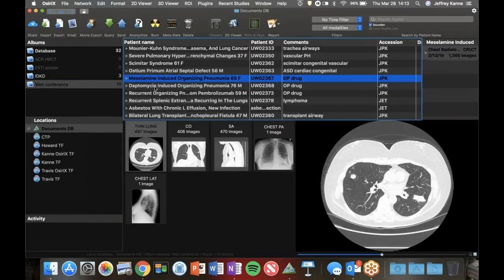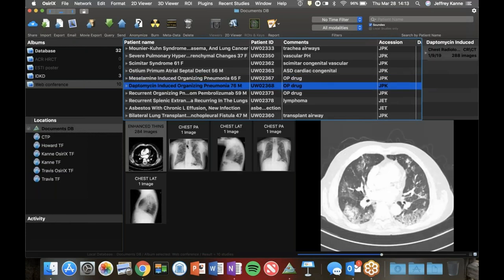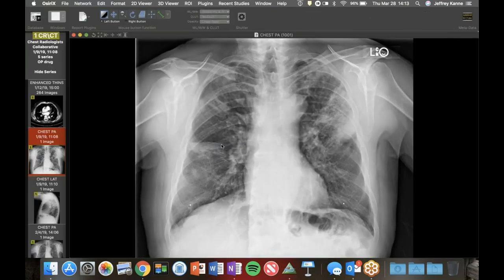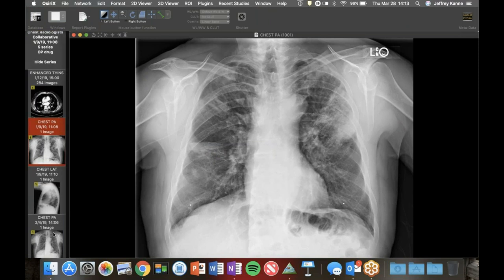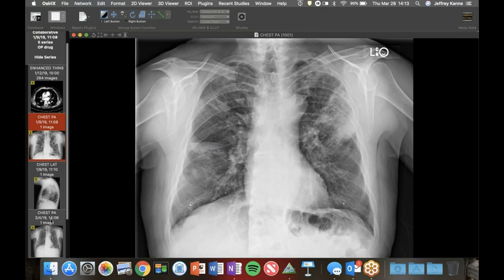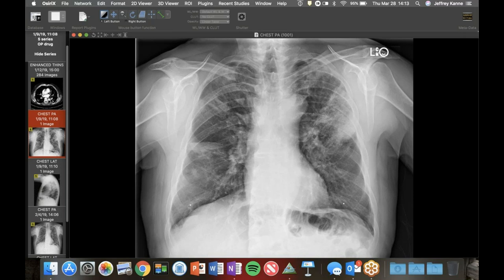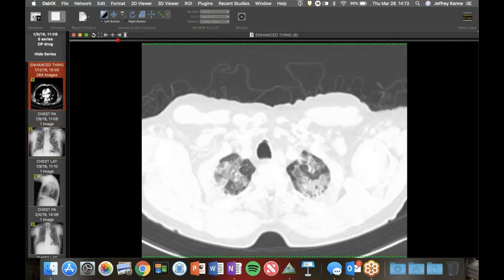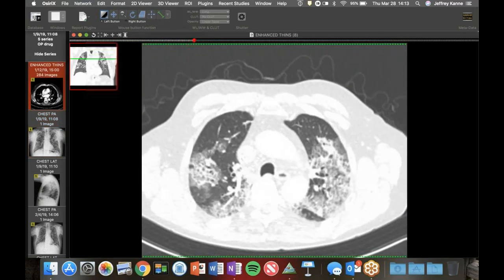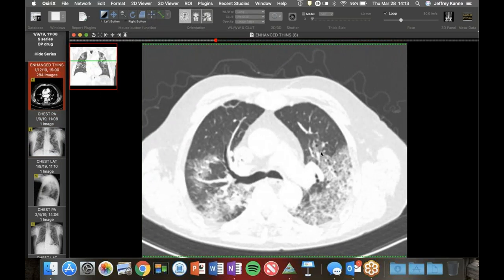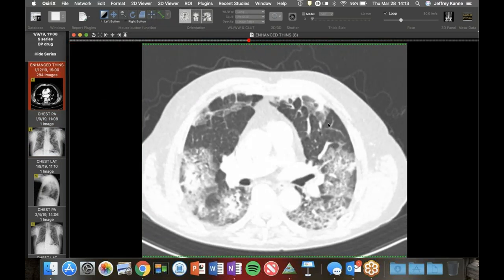I got them backwards - that was actually the mesalamine case. This is the daptomycin, but the patterns are the same. The other patient was on mesalamine for inflammatory bowel disease. That patient presented with multifocal consolidation, nodules, and masses. CT shows more extensive disease. We actually have some crazy paving here, but with the same sharp margination at the lobular margins. I find that a very helpful finding with organizing pneumonia.